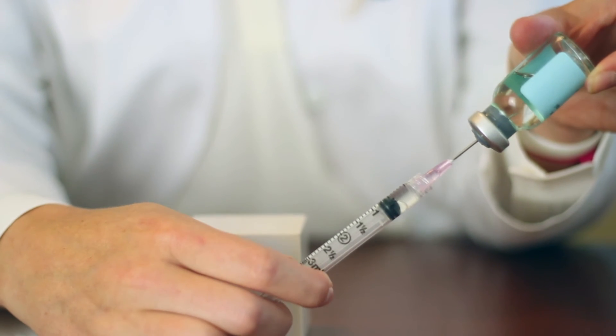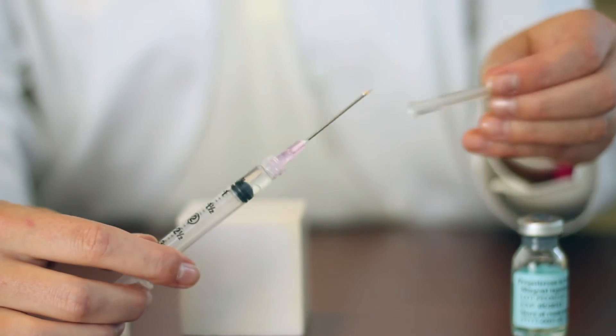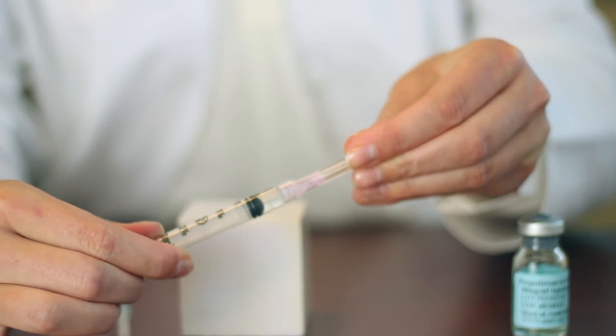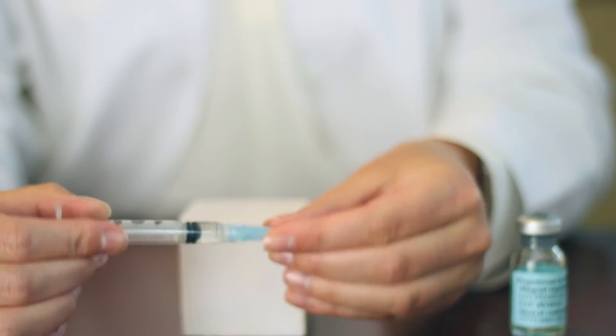Pull straight out. You're going to want to recap the needle. Twist it off. Twist on your injecting needle.